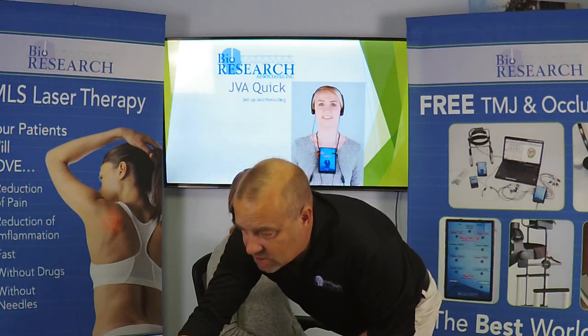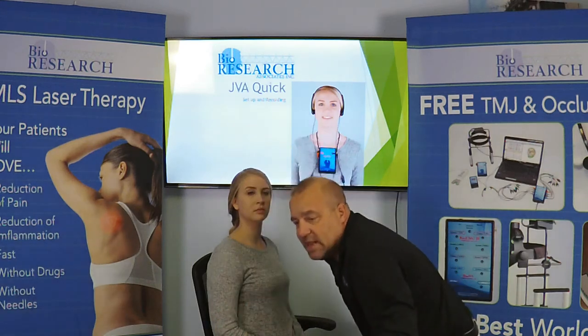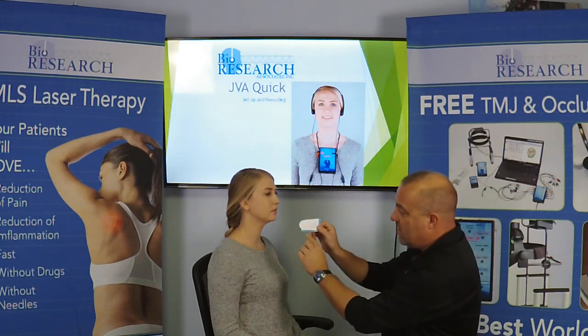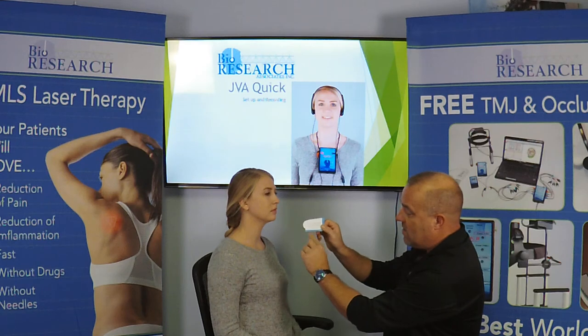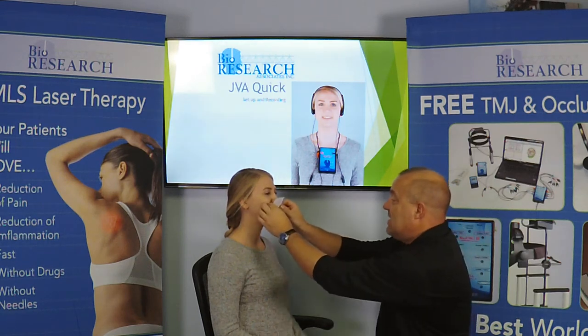Now, as you can see by the asterisks here, left lateral excursion, right lateral excursion, and protrusion are not required unless you're going to use the request a report feature. But I think in the interest of understanding it, this is how we record lateral excursions and protrusion. For lateral excursions, the best way is to take the range of motion card. This gradation down here on the bottom has an arrow. We just say, let me see your teeth. Bite. Put that arrow right on the center of the incisors.